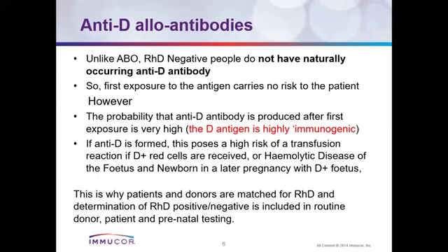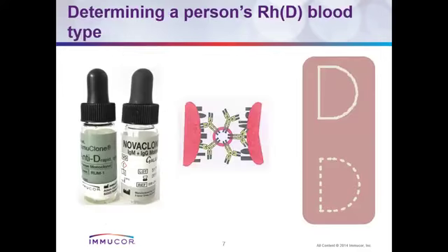So what do we use to determine the rhesus factor? We have commercially prepared anti-sera, we call anti-D, readily available out there. But the challenge with this is that most of our facilities don't validate the quality or the potency of this anti-D. I remember at some point in our practice here, we received a batch of anti-D which was not passing our validation criteria.